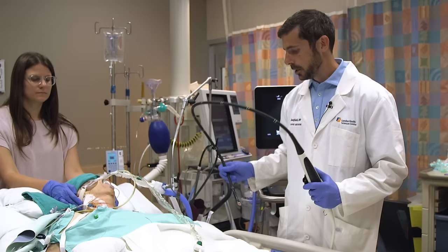We will now do a goal-directed transesophageal echocardiogram to resolve the etiology of shock in this patient. This will be similar to what can be done easily in any acute care environment, including the emergency department, the ICU, or perioperative environment — anywhere with a critically ill patient where transthoracic windows are insufficient, or where you have advanced indications for point-of-care echo. The scope of today is to demonstrate the ease, rapidity, and scope of a four-view goal-directed TEE.